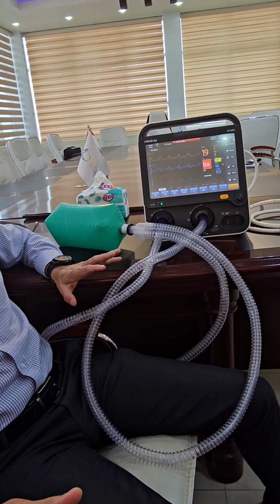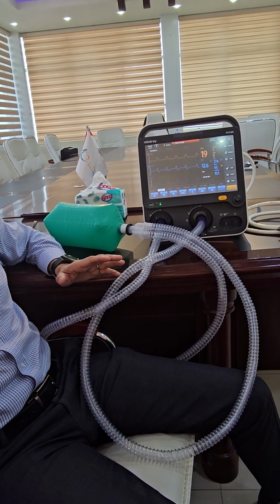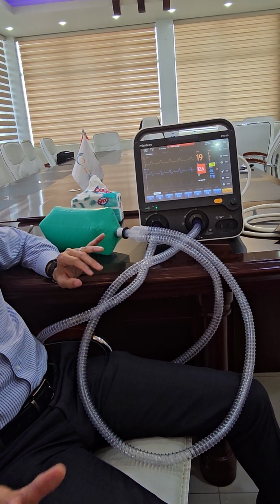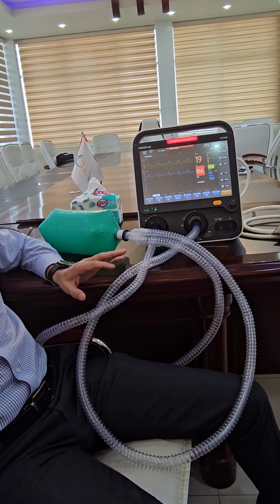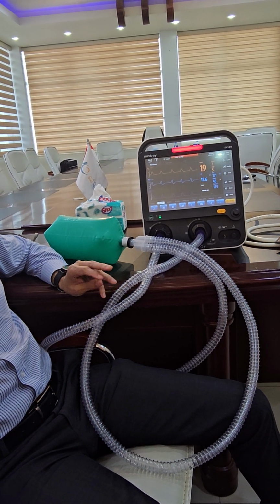Just remember, assisted control. From the name, it provides assisted and control, the mandatory. What will you not see in this mode? Spontaneous. You will never see spontaneous breaths in this mode. Control means mandatory, what you control. Clear? That's one, the type of breath.